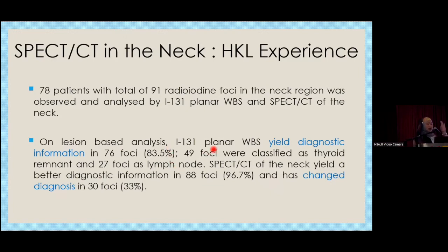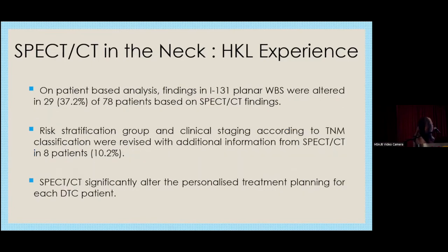So this is very important. When you do a whole body scan in 3 patients, you can actually detect more information in one of the patients. On patient-based analysis, SPECT-CT altered the planar findings in about 37.2% of patients. The risk stratification group and clinical staging according to the TNM classification were revised in about 10.2%. And definitely from this study, it shows that SPECT-CT significantly altered the personalized treatment planning for each DTC patient.